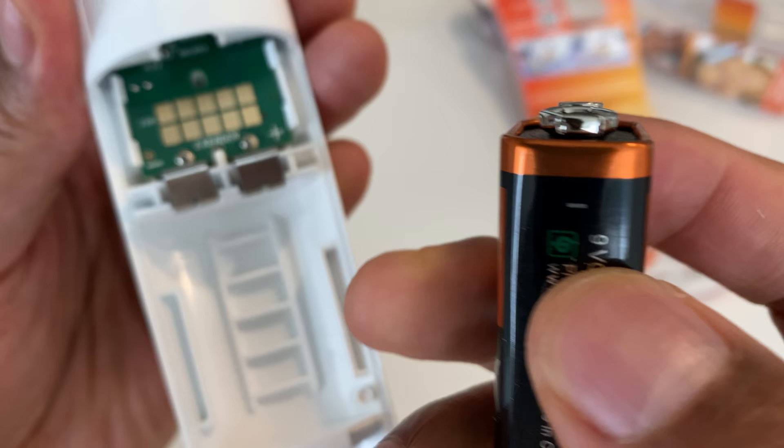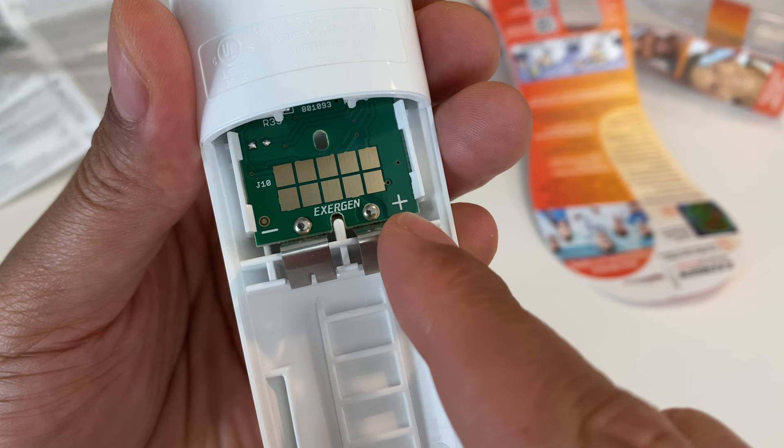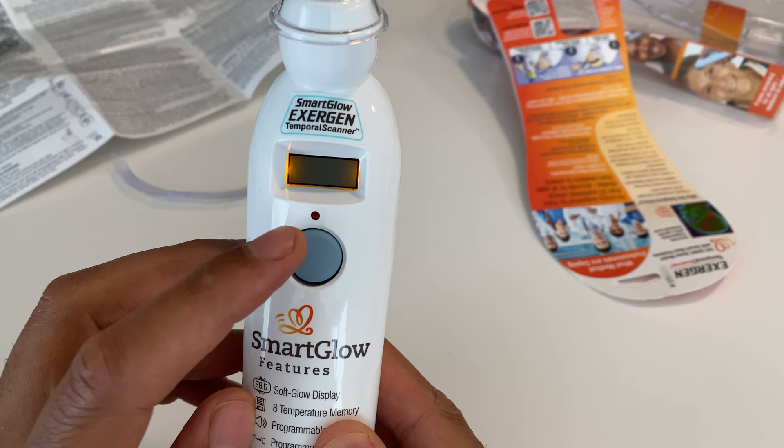I'm going to open the back and put the battery in. There's a positive side and a negative side on the battery. I look inside and the positive is on that side, the negative is on that side. I place the battery in and press it down, then replace the cap.